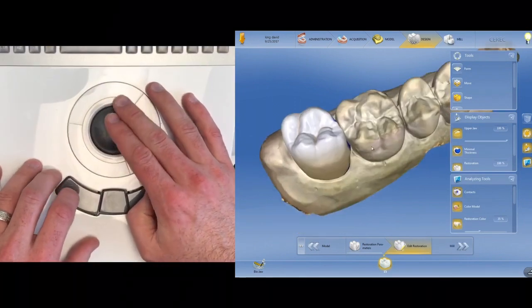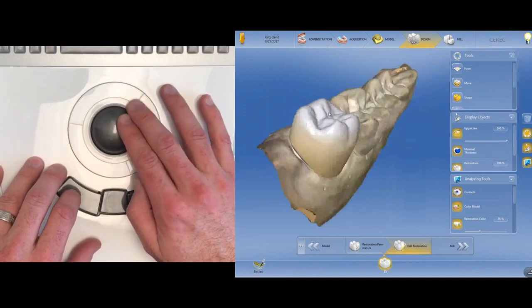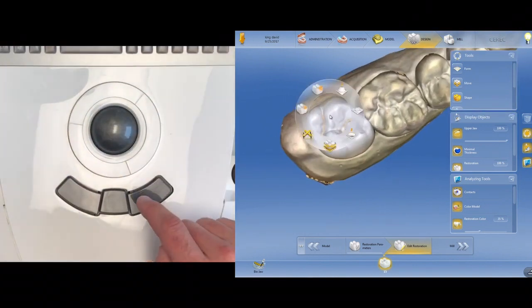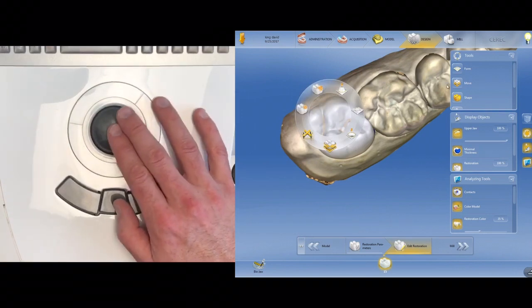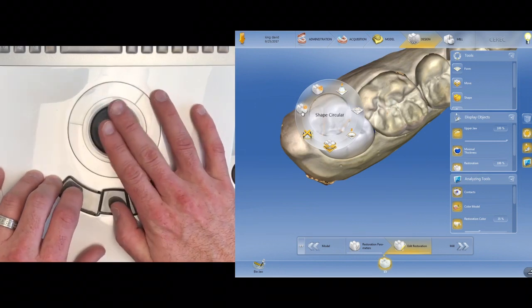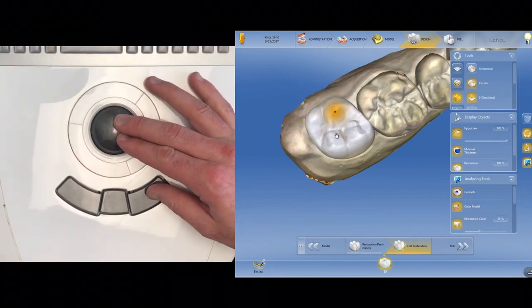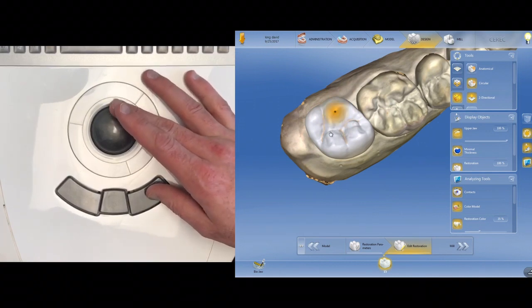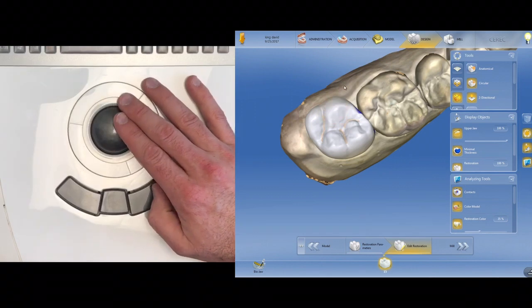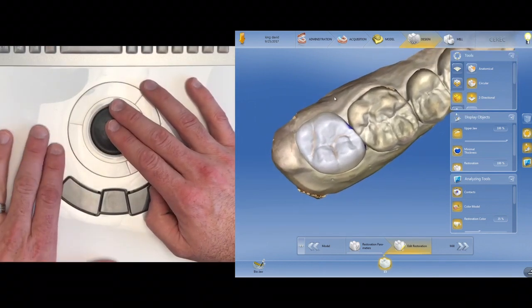Your tool size can be changed, and this is way off. I'm not going to spend any time editing this. But your tool size can be changed. So if I hit the right button to turn on my tool wheel, or go over here and select a tool, let's just say I select my circular shape tool. I can change the tool size with the right button by pressing and holding and zooming up and down over the tooth, the restoration. If I'm over here, I'm going to be panning. If I'm off of the restoration, I'm panning, if that makes any sense.